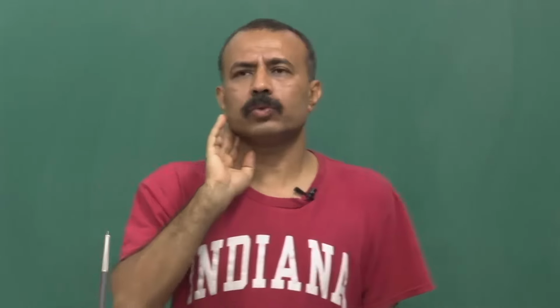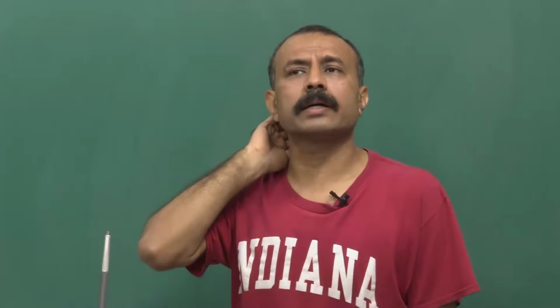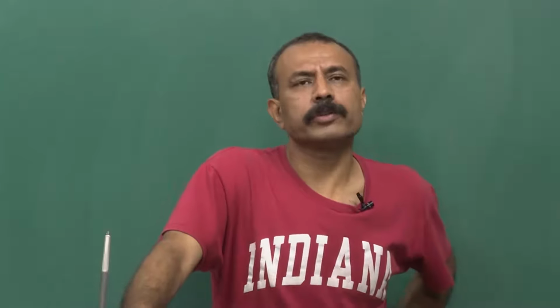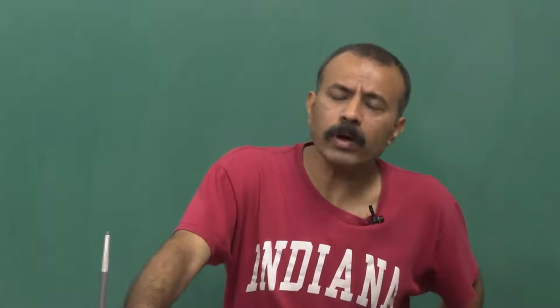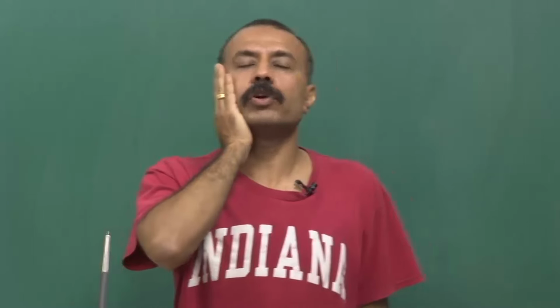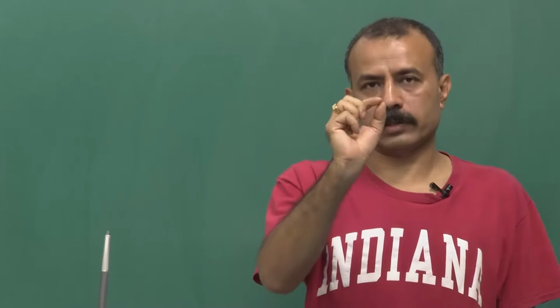But I will recommend that if possible go for a primary culture, take the tissue directly from the animal. One of the best sources over the years, if you have access to pregnant rats, I would say E13 to E14 hearts.